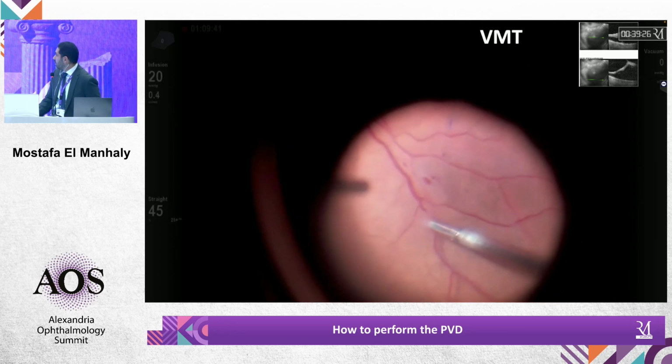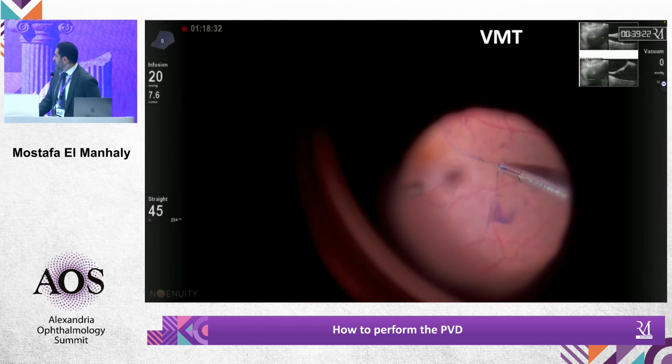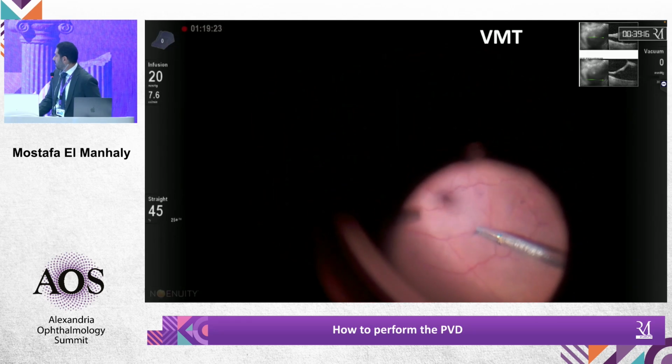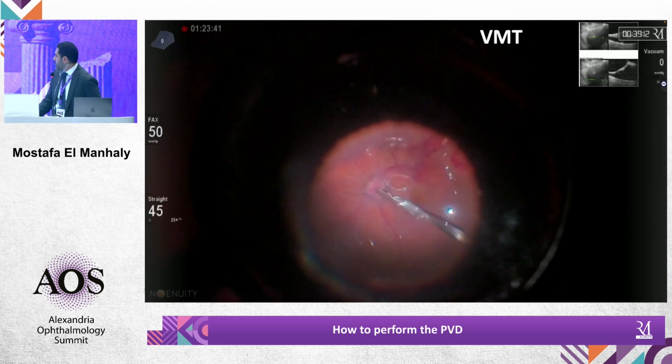The idea is you can trim both together. You can trim both the epimacular membrane and the ILM, and you stop where, if you have traction like this at the fovea and you're afraid to deroof the cyst, you can stop at the fovea. I usually use very low suction and very high cutting, just to trim it, to leave minimal foveal sparing. I just leave a very small stump there, and I don't insist on removing it completely. Dr. Hassan, please.